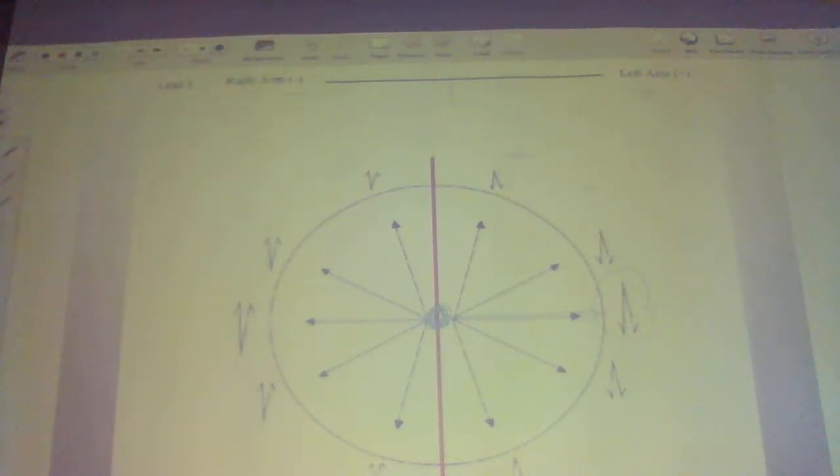Again, this is the territory of positive, and therefore any time there's depolarization of the ventricles in the direction to the right of the screen here, you're going to get a positive deflection on your EKG, and that QRS complex therefore will be upright. Now, if the opposite happens, and we get depolarization in the direction of the right arm, meaning away from the positive pole of the left arm, then we're going to get our deepest QRS deflection.